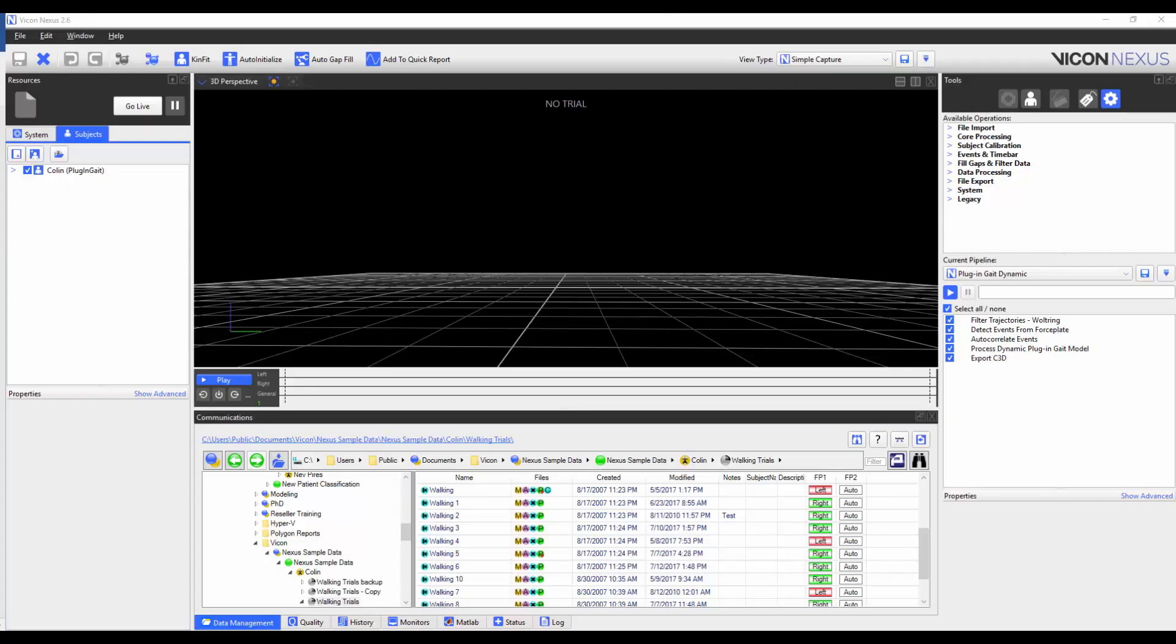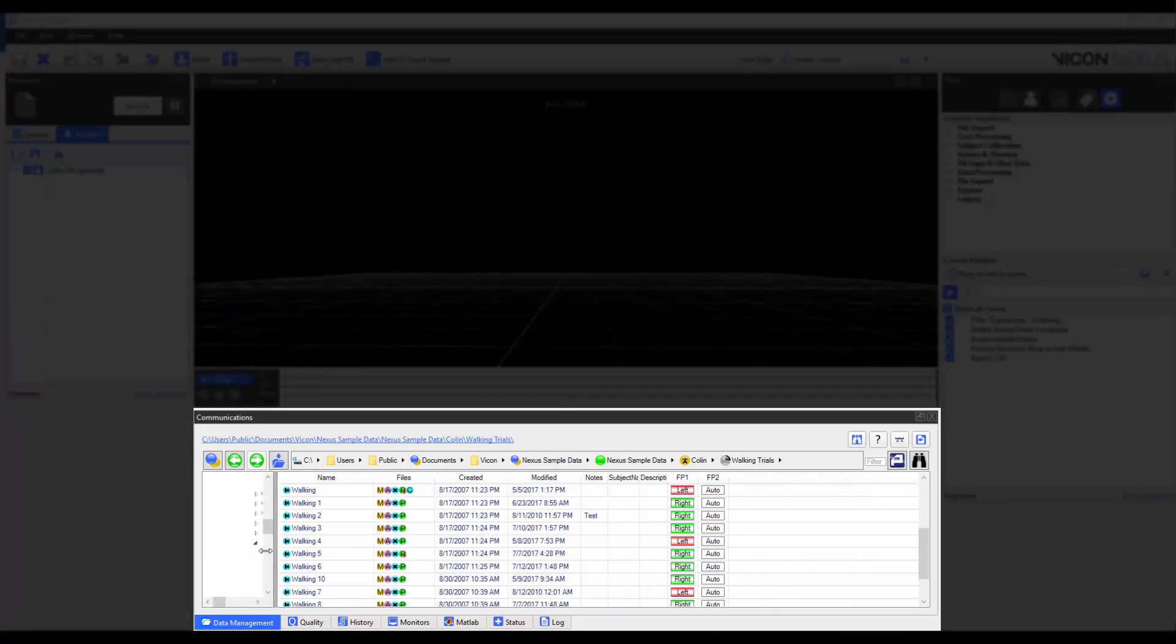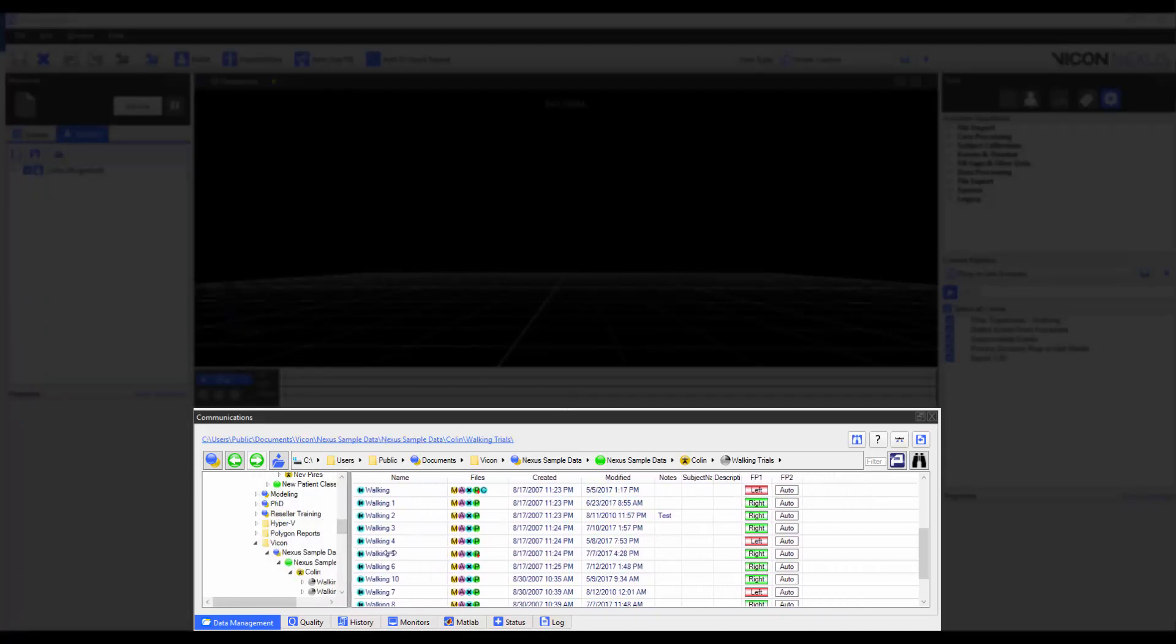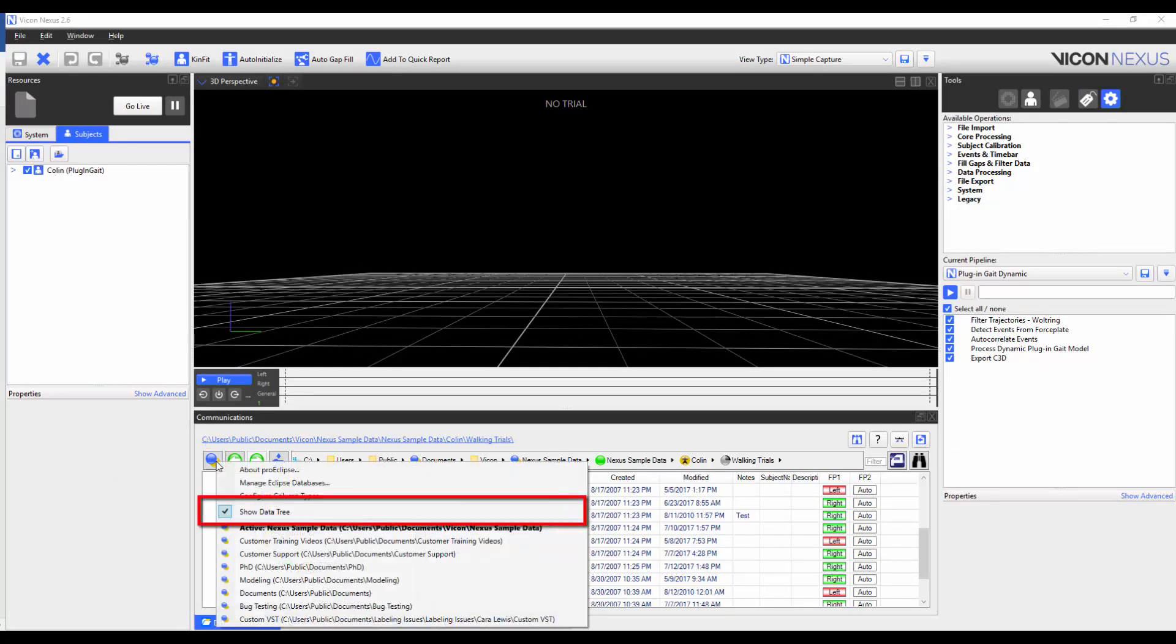There are a number of improvements to the data management. You can now adjust the size of the divider between the tree view and the data pane. You can even hide the tree view completely by clicking on the Eclipse menu button and deselecting Show Data Tree.